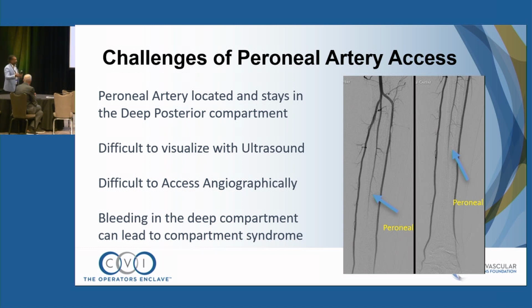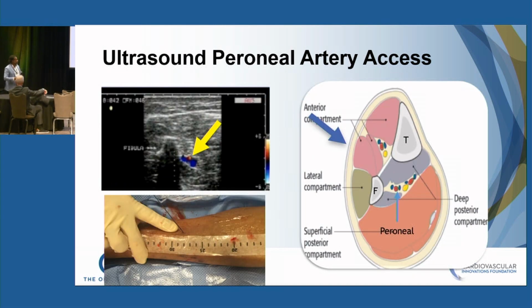So it takes maybe about 5 minutes or so. You just advance a little bit, you take a little shot, you keep going, then you go orthogonal, and then you'll really start to see, and you'll feel, or you'll even see that artery moving as you pop in. You're approaching this medially, right? Medial, yes, I have a shot of it for you.